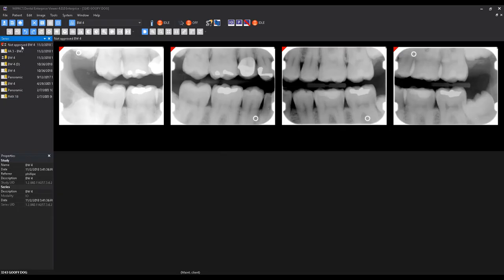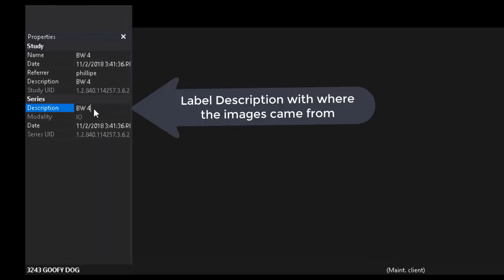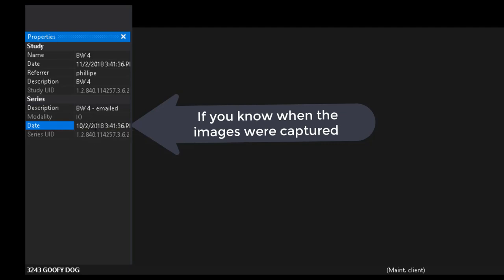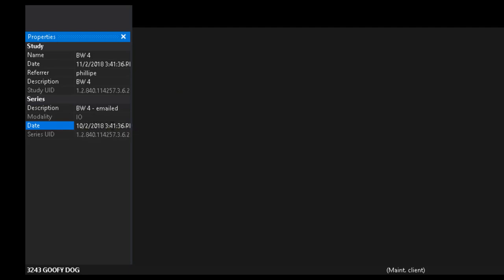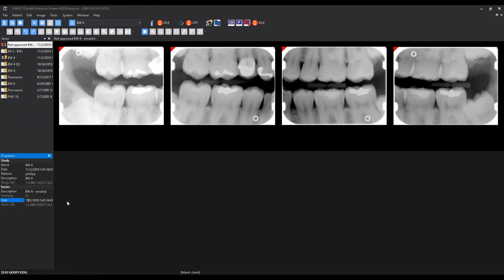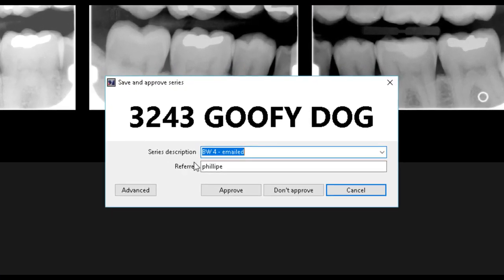Once you are satisfied with the image layout, you will want to ensure the series description and date and time are accurate. If they are not, you can alter them in the Properties pane. After all changes have been made, you can now save the series to the DICOM server by selecting the Save icon from the toolbar and clicking Approve.